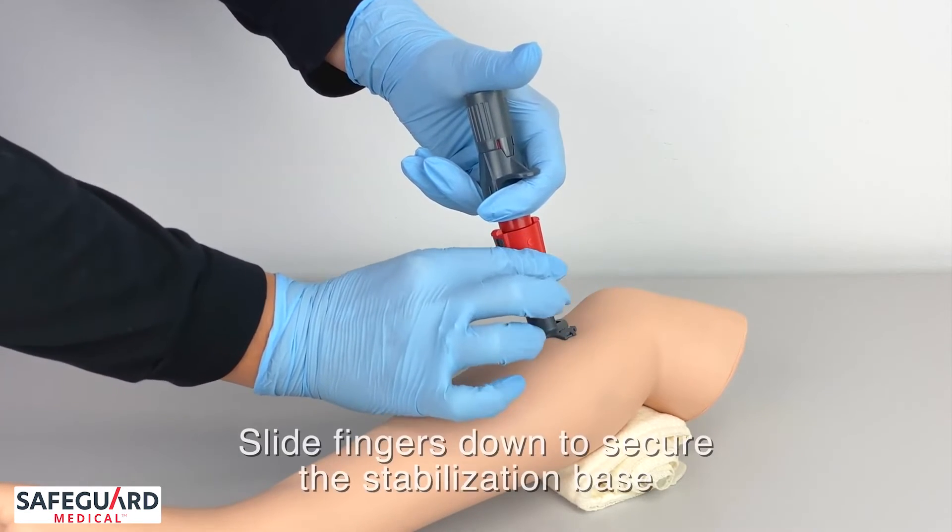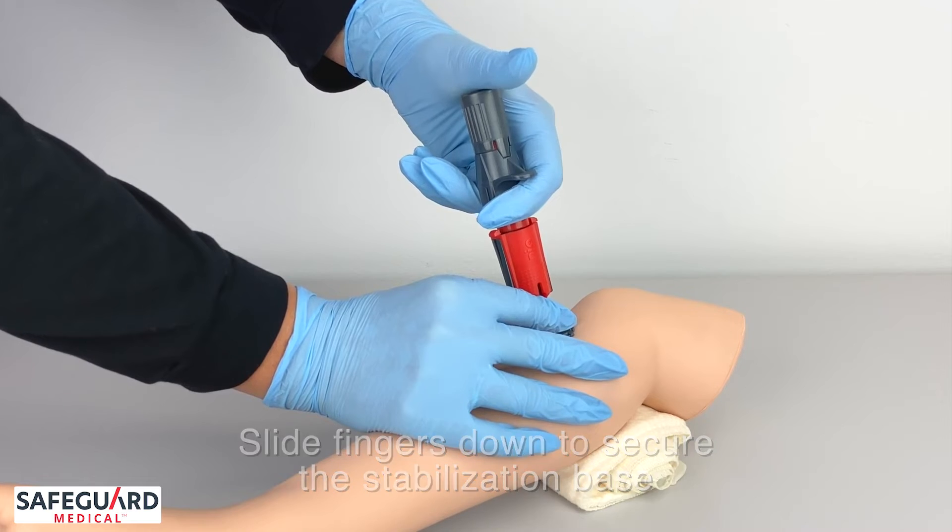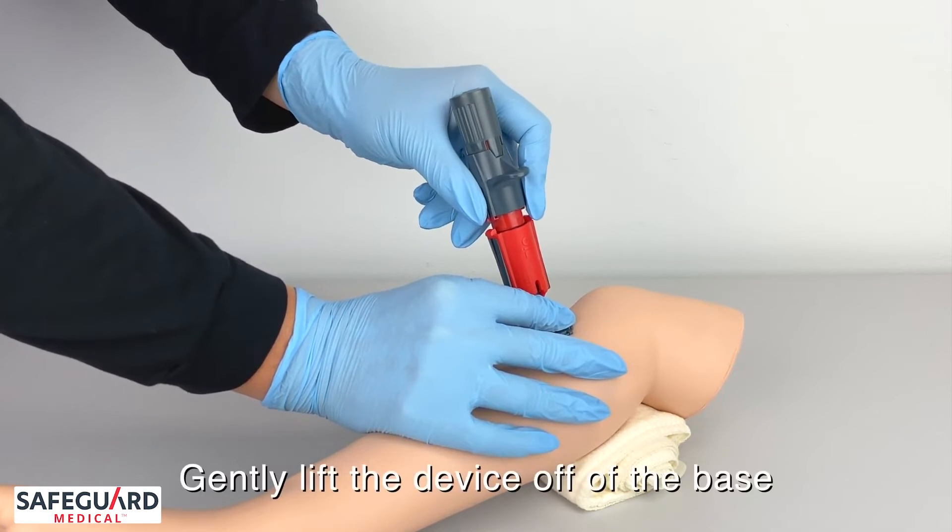Once I've deployed the device, I'm going to slide my fingers down to the stabilization base to stabilize the device, and then gently pull off.